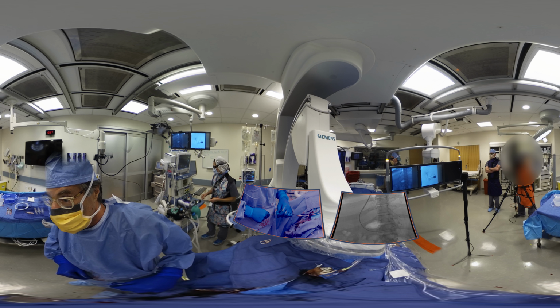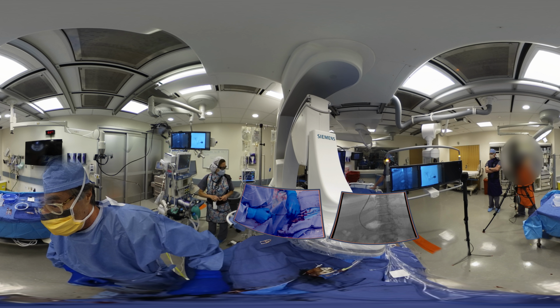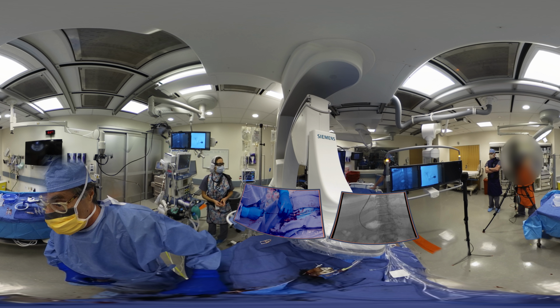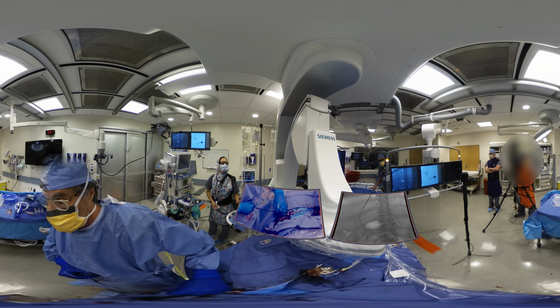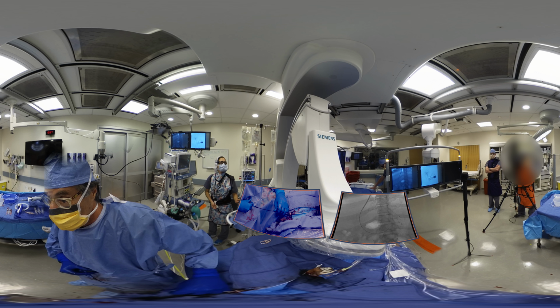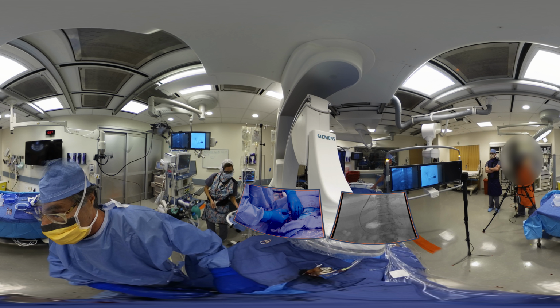This procedure is being done purely for pressure reduction, not for varices. So that picture of the large venogram is not essential, and if his creatinine were elevated and his GFR were low, as it often is in the ascites patients, I may not even have taken that picture that I did, saving all my imaging and contrast, or I'd be using CO2.